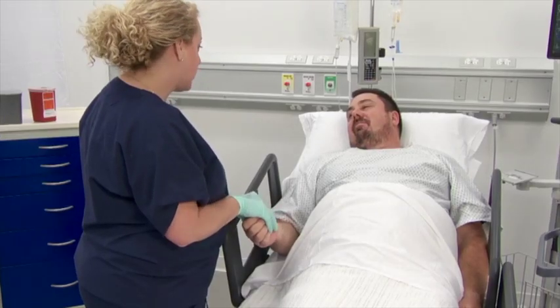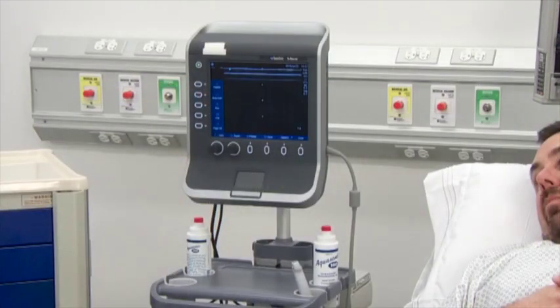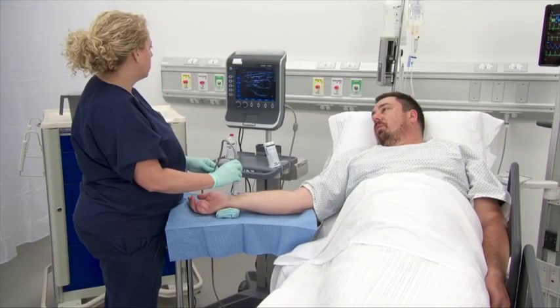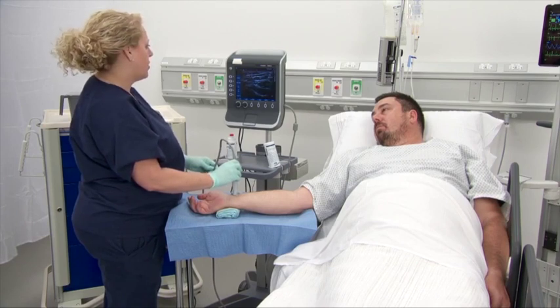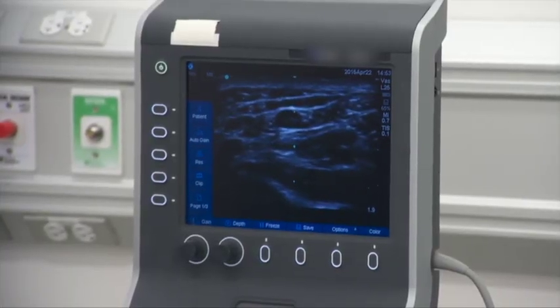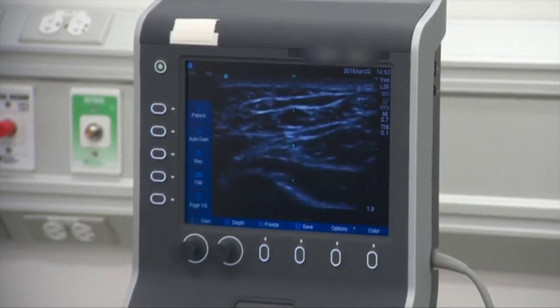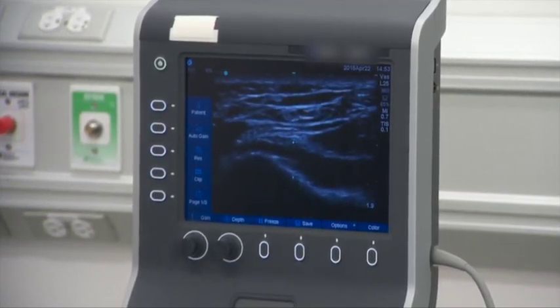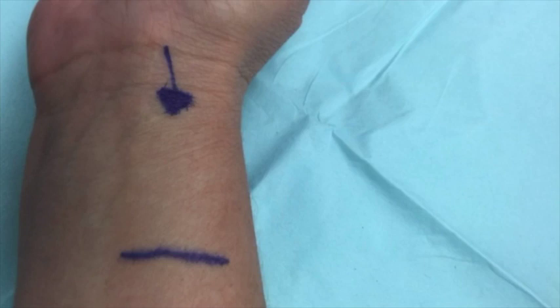Prior to insertion, adjust the bed to the proper height and ensure that the ultrasound machine is in the proper position and easily accessible. Perform a vessel assessment using ultrasound. Using the probe, assess the intended insertion location for the optimal insertion site. Assessment should include the vascular anatomy, vessel depth, and nerve pathways that may inhibit a successful insertion. Avoid choosing a site that would interfere with the range of motion post-insertion. This zone shows the optimal insertion area for radial insertion to minimize mechanical complications.